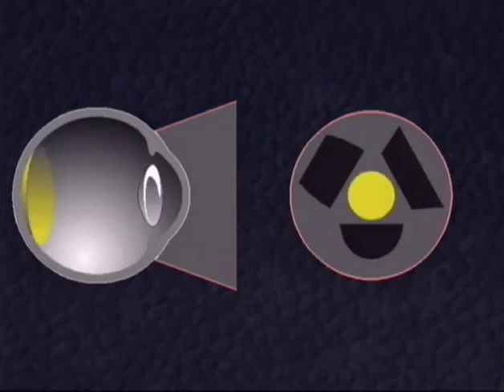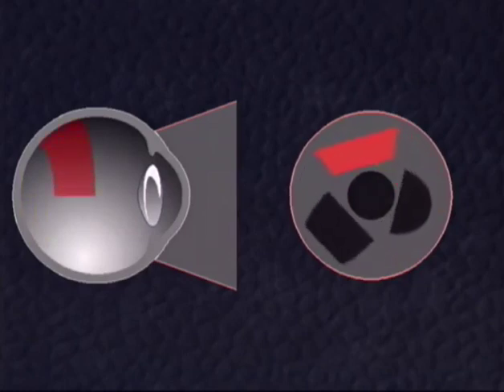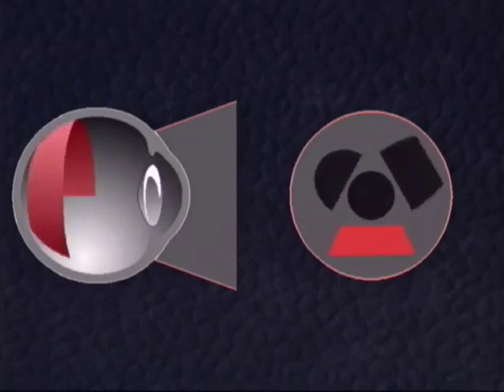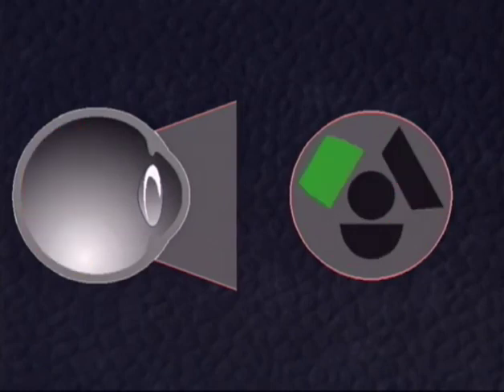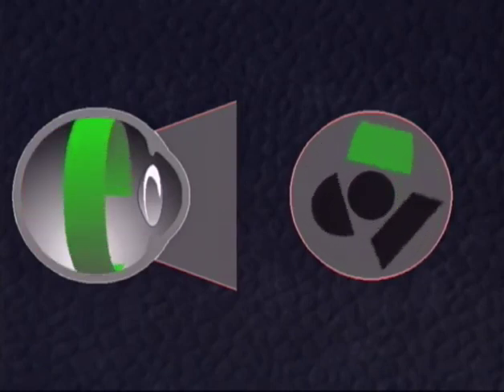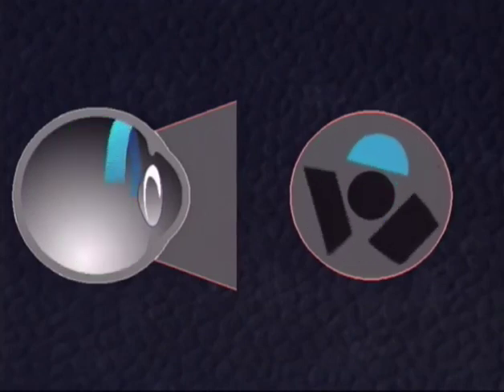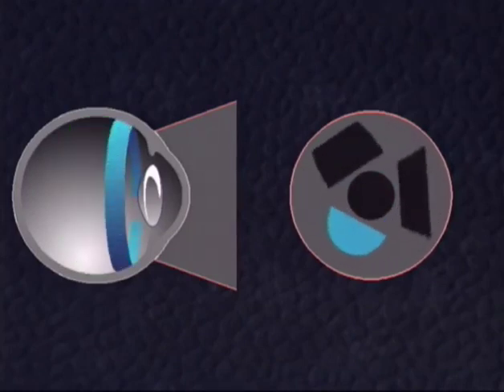The posterior pole of the eye is observed through the central portion of the contact glass. The more peripheral parts are seen through the mirrors with different inclinations. The steepest mirror gives access to the mid-periphery, and the intermediate mirror to the equatorial fundus. The flattest mirror shows the pre-equatorial fundus and the region of the chamber angle.